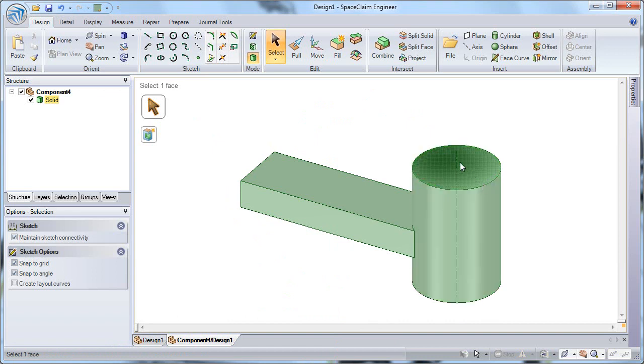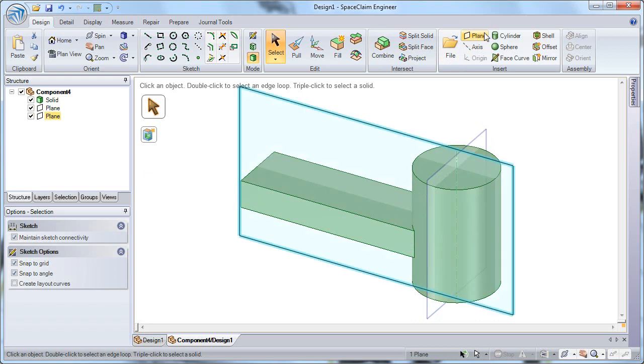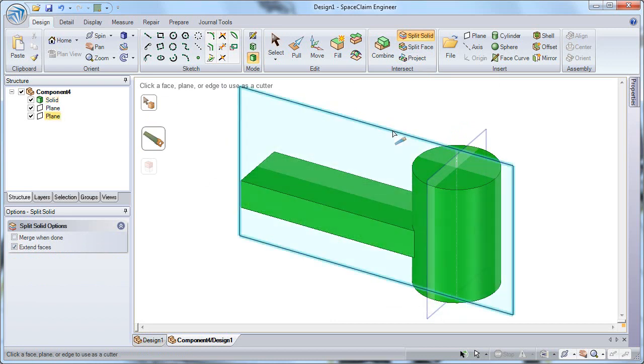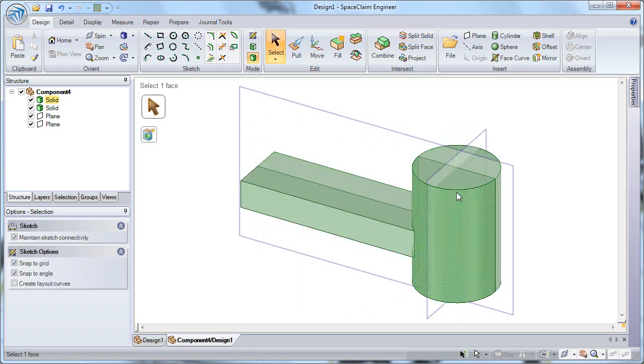Now I want to split this base, so let me select on the axis going through the cylinder, create a new datum plane, and you see that it's oriented the wrong direction, but I can easily add additional references by selecting on the axis and then using my middle mouse button to scroll to select the back face. Control select both of those, and now it'll create a plane through the axis and normal to the back face of our base. Using our split solid tool from the intersect group, I can select on my solid that I'd like to split, select on the plane as my splitting plane, and you see that I've now split that base into two separate components, or two separate solids.